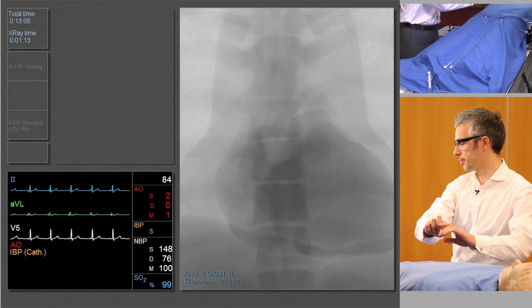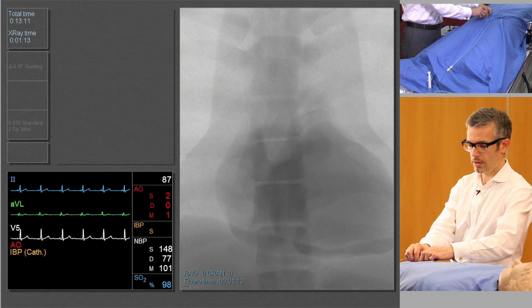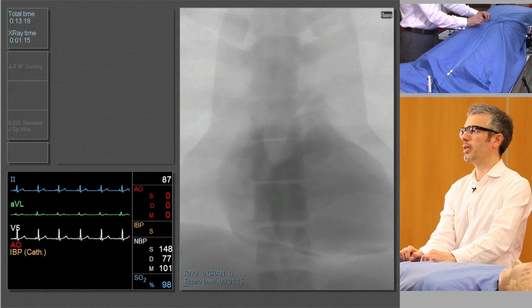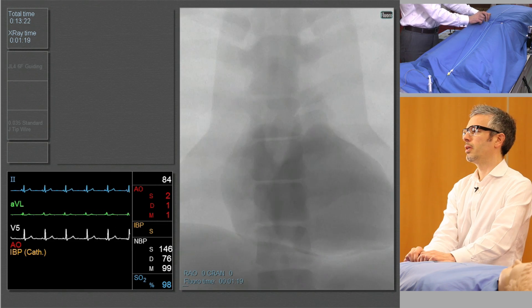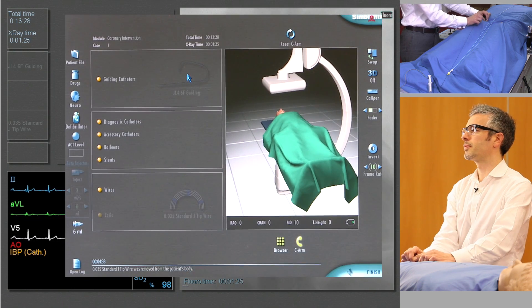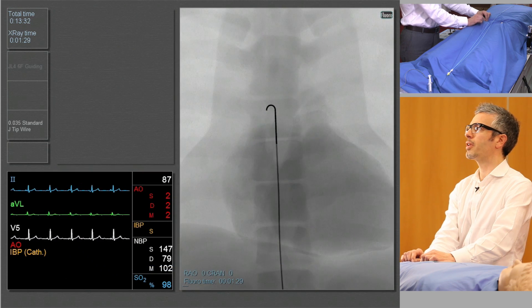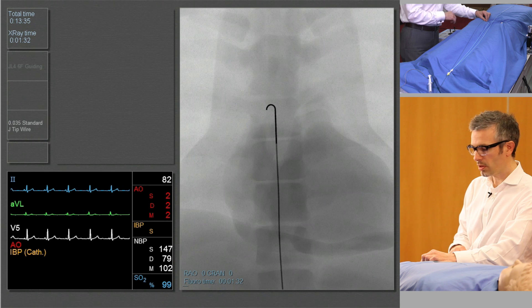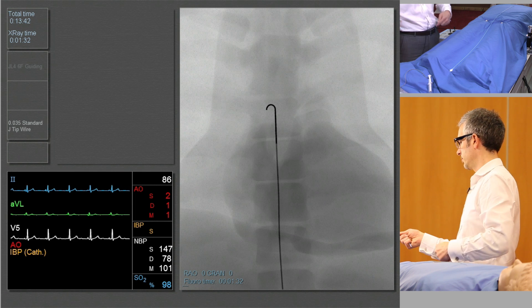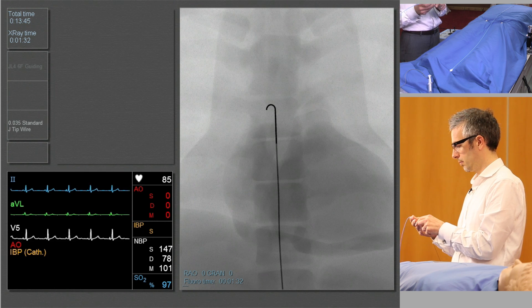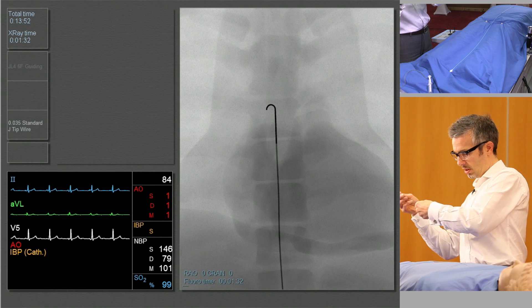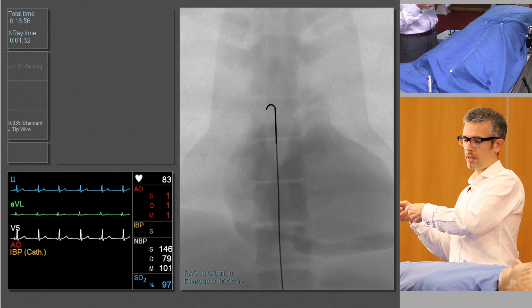So we're going to start with our guide wire, and it's inserted through the femoral sheath. I'm going to be screening on fluoro as we go. The first thing that we'll see is the appearance of this J-tipped guide wire in the abdominal aorta, and there we go crossing up into the thoracic aorta — we can see our J-tip. I'm now going to select my guide catheter and thread this over the wire, fixing the wire's position and bringing the guide catheter up closer to the tip.